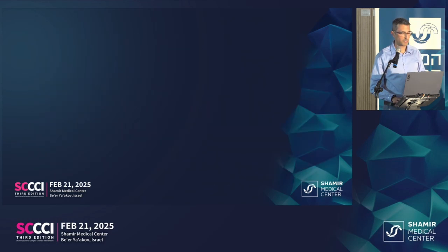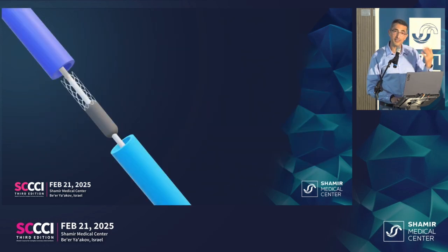And for that, because this is not very clear, I have a 3-dimensional example, or a model. So we kicked off like this. We had a catheter at the top, catheter at the bottom. We had a balloon here, and the stent was here.